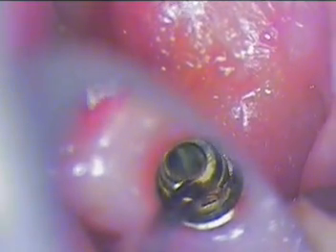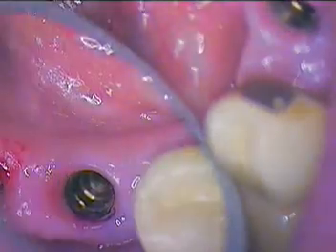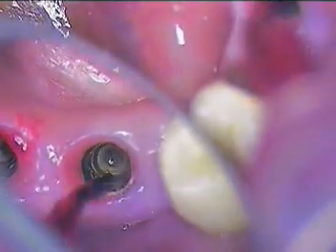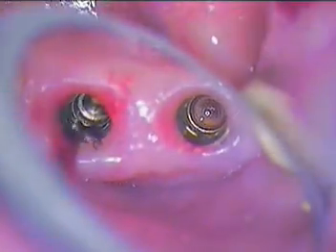Julia, you might feel a little bit of water squirting up. I've got to get in there with a special cleaner — we use chlorhexidine gluconate, which is our cavity cleanser, and we have it on a small brush, so I've got to clean that thoroughly. Otherwise we're going to have a problem with our impression taking. I'm going to go in there now with suction, close with a small suction. That debris could also be some material from the graft — I'll have to ask my periodontist that question.